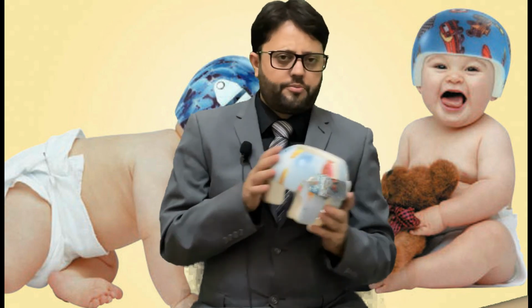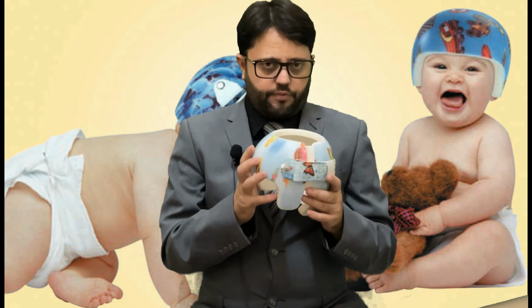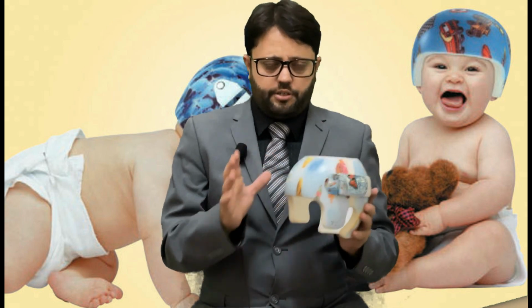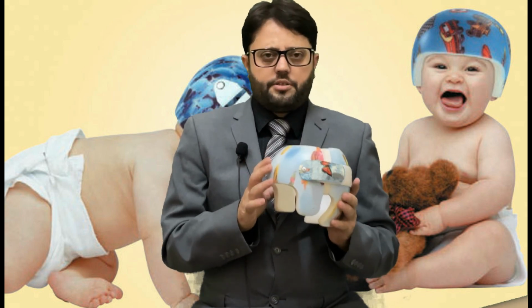There are a lot of problems at the beginning. It will be loose, and there will be a lot of movement. We need to look at everything. After 1 week, there is an appointment every 2 weeks. Every 2 weeks we do a cranial scan. We compare the head and can see the visible growth from computer-generated reports. In the system, we can see that this much growth has happened in the right direction.